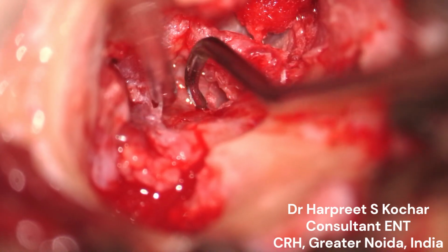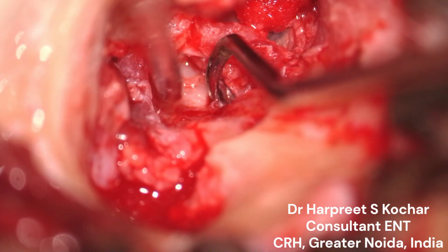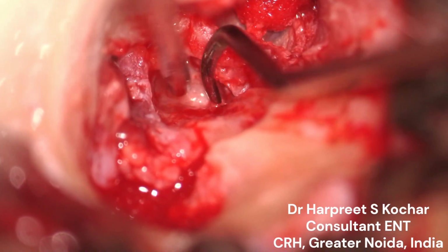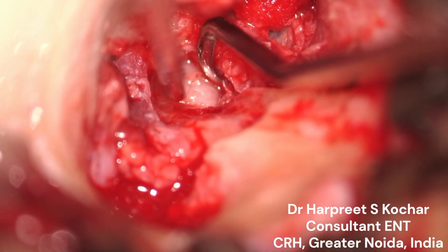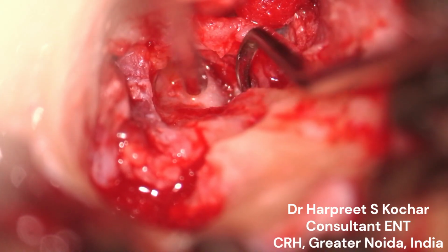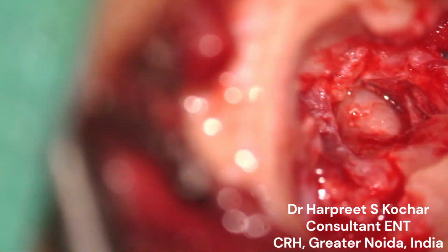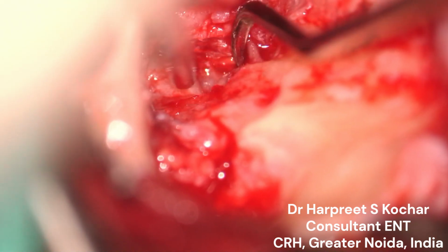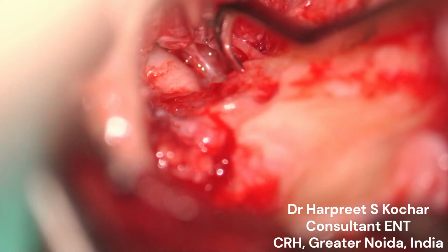A whirlybird instrument is a very essential tool in removing the epithelium from hidden spaces, in this case from sinus tympani as well as the facial recess area, the suprapyramidal recess and the infrapyramidal recess. So the epithelium is being lifted up till the stapedius tendon, which comes into view briefly. We can also note the corda tympani, which is being stretched above.